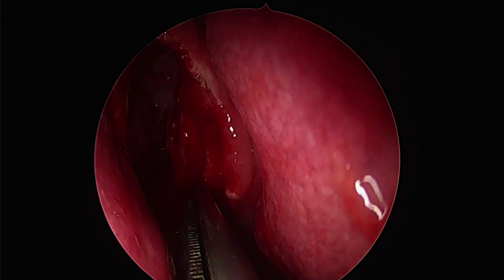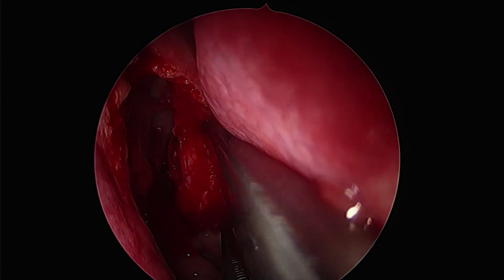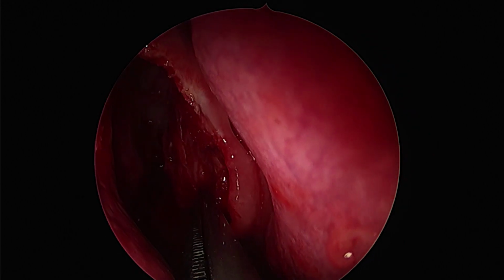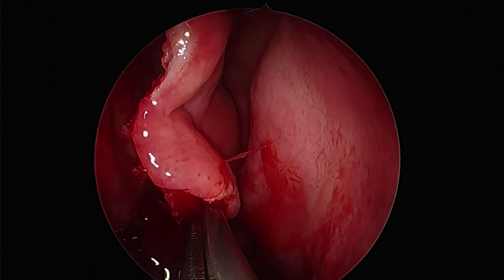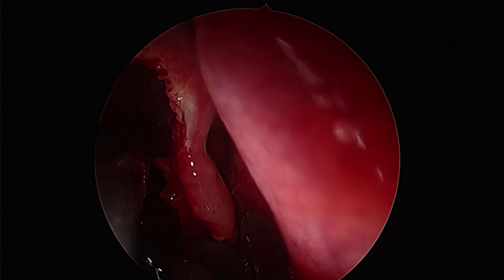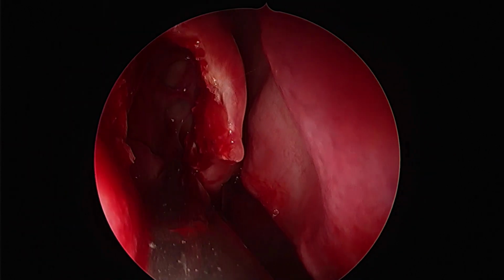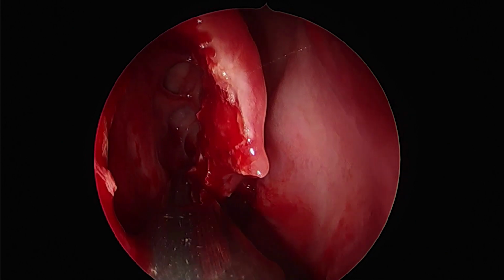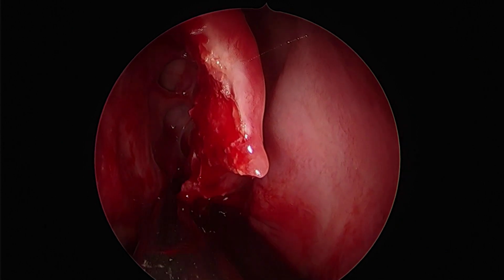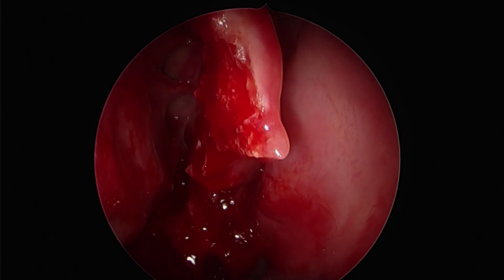However, still, since we are to access the small sphenoid and the Onodi cells, we take the call to remove the middle turbinate partially, at least the inferior third or half, while preserving the superior half at least. Once again, a caution to not go too superiorly, to avoid having a floppy middle turbinate that can create troubles in the frontal sinus drainage pathway.